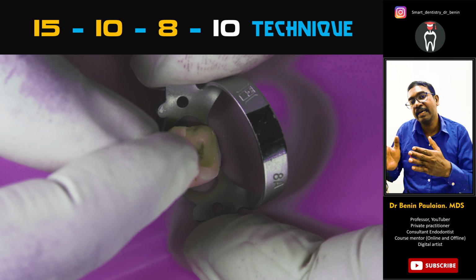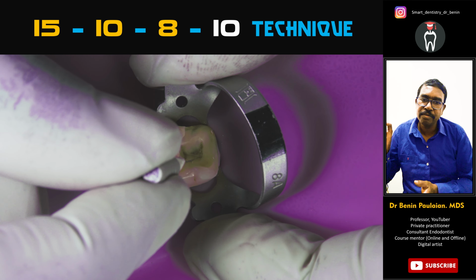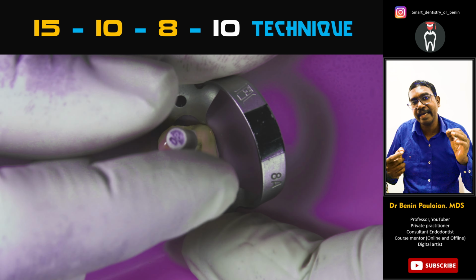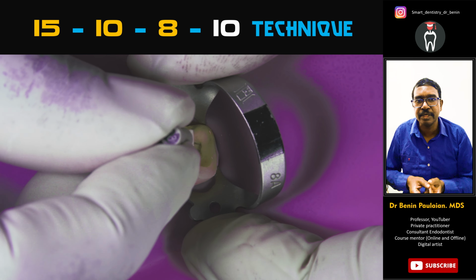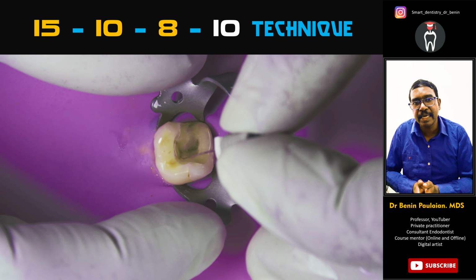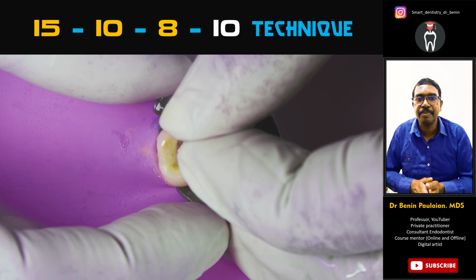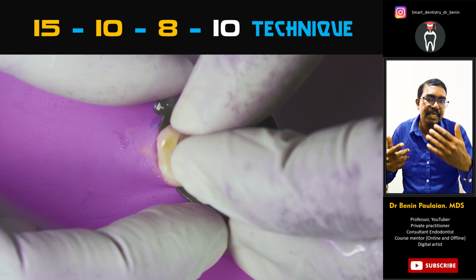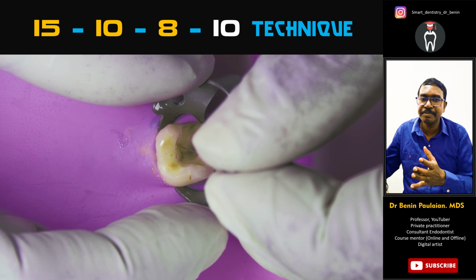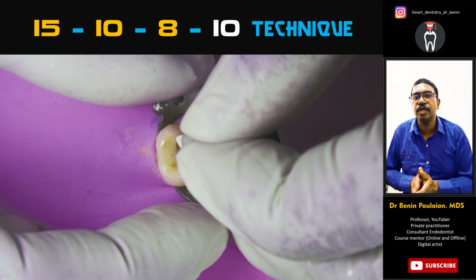Why? Because we have already enlarged the coronal and the middle third. Now it is the apical part, the 8 size file without any coronal interference. What happens is, if you directly take an 8 size file and try to negotiate, the calcifications from the coronal part will move towards the apical part because they are loose, and will block the apical part of the canal. So as we have already removed these calcifications and we have a pulp chamber filled with sodium hypochlorite, this blockage of the canal is not going to happen.